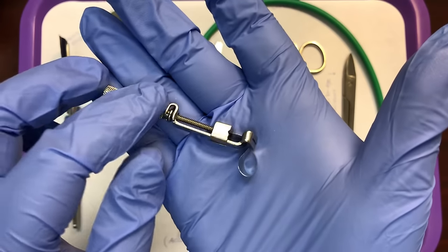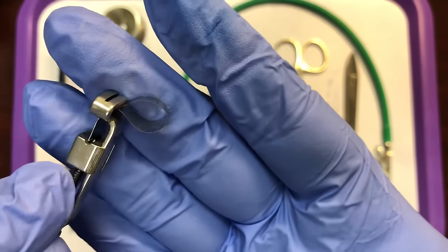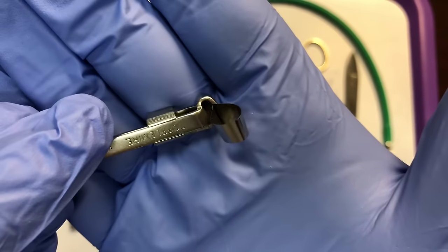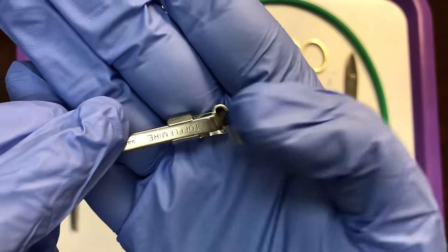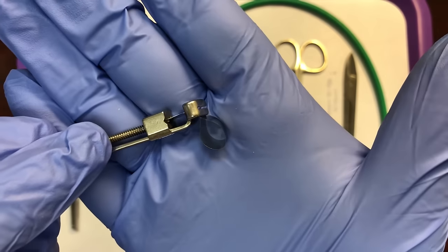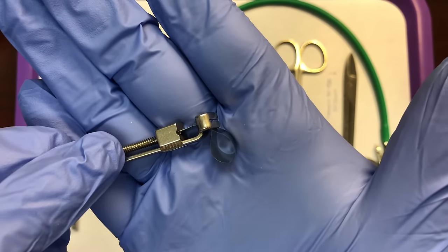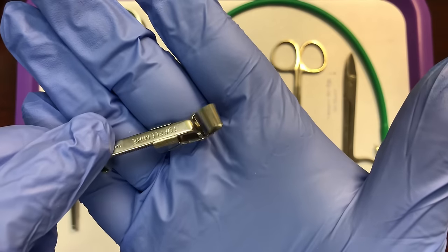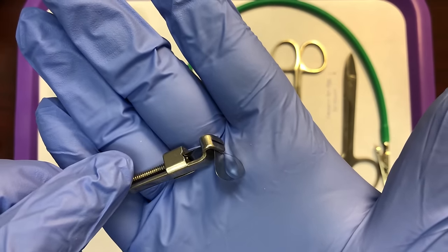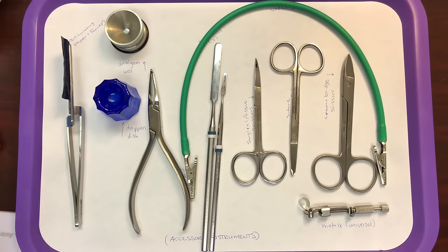This right here is one style of matrix system. The loop sits around the tooth and creates a temporary wall. When the tooth is prepared and we have a mesial or distal preparation, there's no wall there because the doctor removed it due to decay. We put a temporary wall around the tooth so we can put the filling in — the wall helps hold the material in place. Once the material is set, we remove this temporary wall. Matrix systems create a temporary wall to help support the restoration. We'll have a whole chapter on matrix systems covering three different styles.